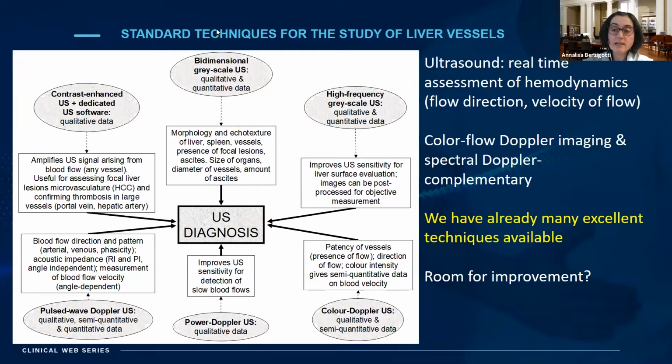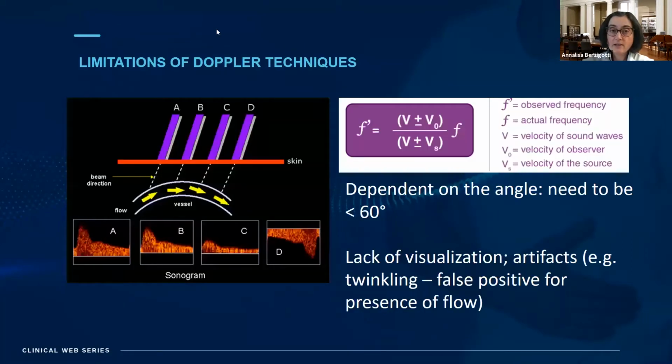So we have many different techniques available, and many of them are excellent, and we use them day by day. But is there still some room for improvement? I believe there is, because I think you are also all aware of the limitations of Doppler techniques, which are mostly due to their dependency on the angle, due to the Doppler equation.